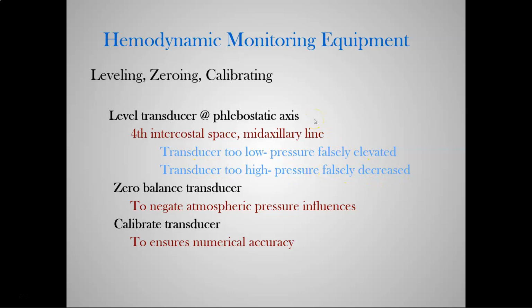If your patient moves, and this is something that happens all the time, especially with newer nurses in the ICU, and I touch on this because it's one of those things that's easy to fix. Sometimes we freak out: oh my gosh, my pressures have been great all day. And by great, I mean you have them on 3-4 pressors. They've been 100 systolic on the button, and all of a sudden they're 80 systolic.